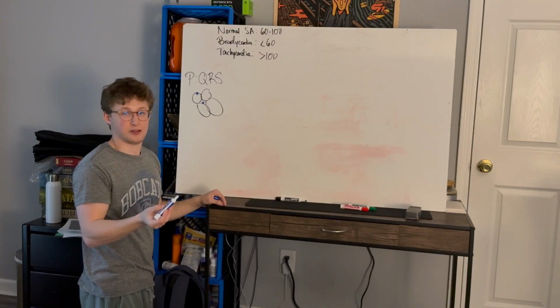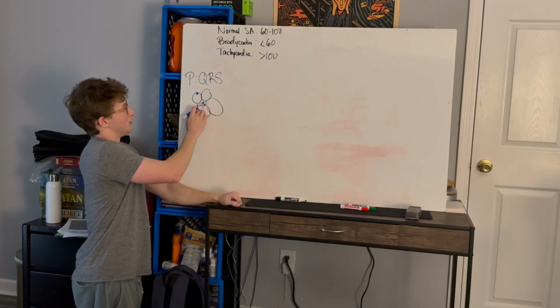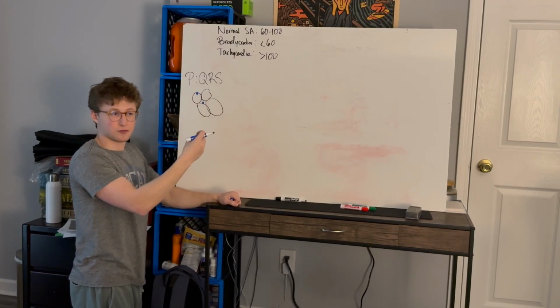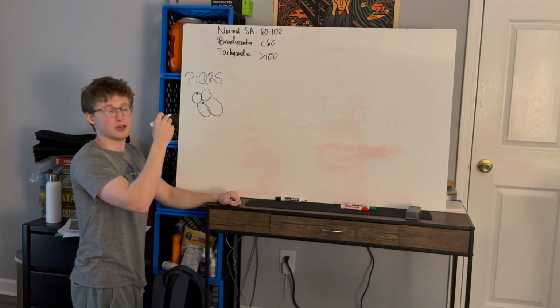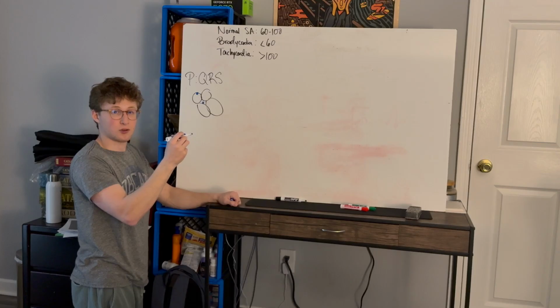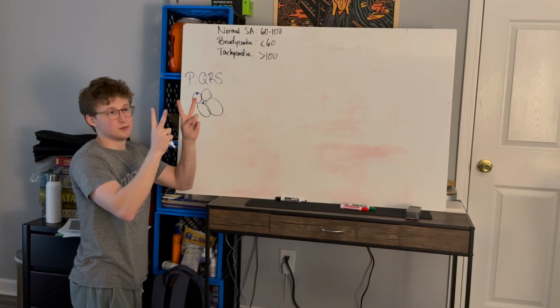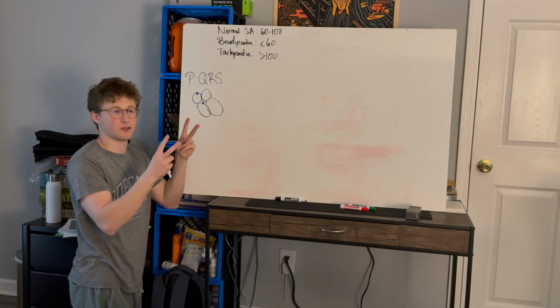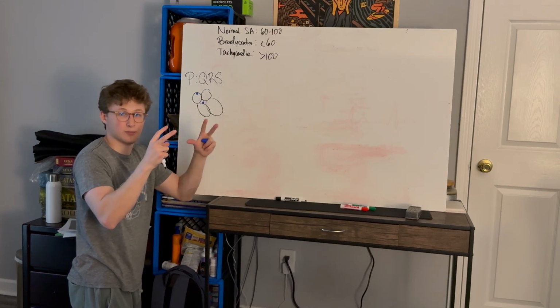Why? When would we not see that? If we have atrial fibrillation or atrial flutter, we may have an issue where we are seeing multiple P waves or many pseudo P waves. They're not really P waves when talking about atrial fibrillation, because they're not really coordinated to create a P wave, right? It's a bunch of little impulses.